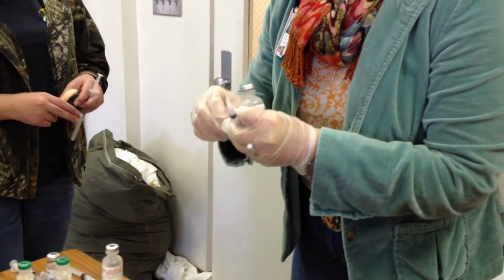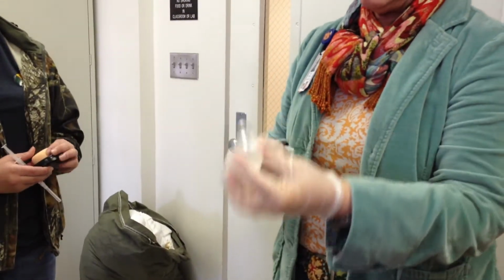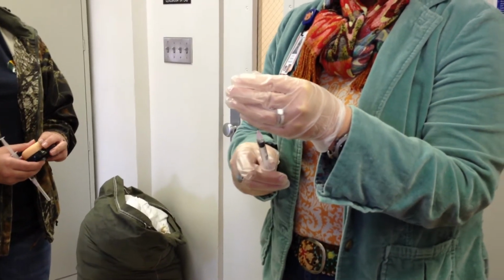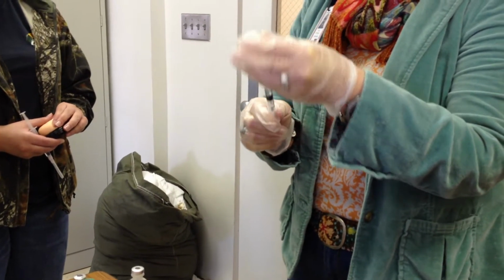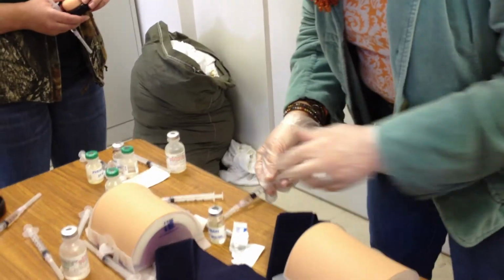Okay. We're going to draw up. We verified everything. We're going to draw up our mL. We've gone in these vials so many times I don't have to inject air anymore for it to flow well, because they've been depressurized so long. Okay, so I'm going to draw up a mL. That's what my order says. So we're going to be ready. I've done all my verification.